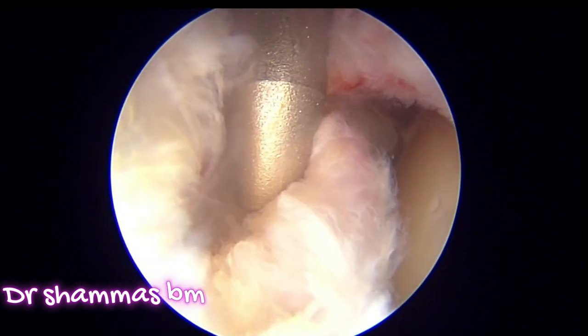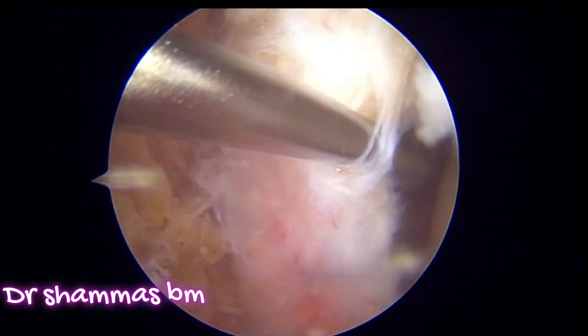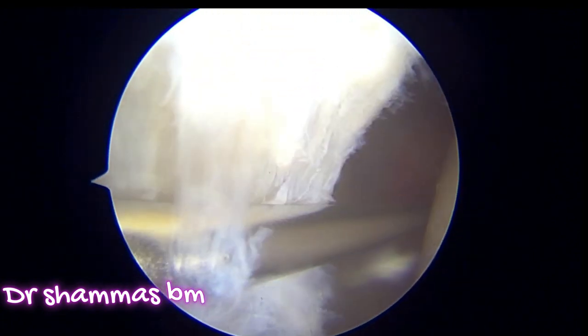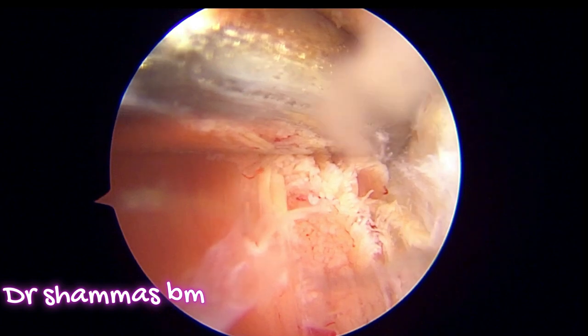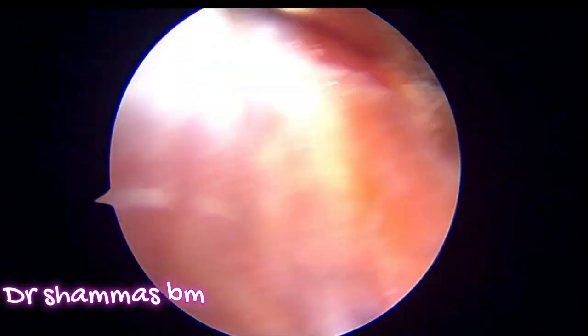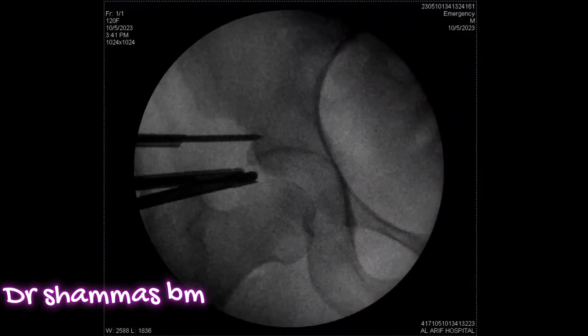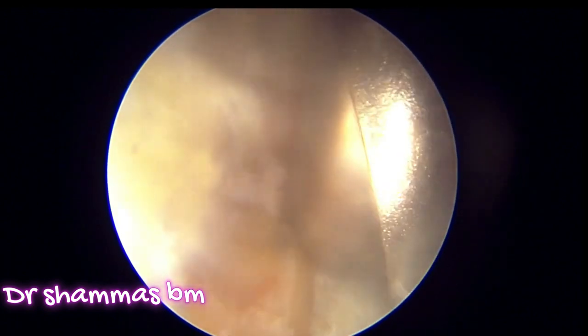We need a third portal for completing the procedure — we are using an accessory anterolateral portal. We put the cannula and repeat the same procedure as above; you can confirm placement with the image intensifier. Here I am using a Steinmann pin to remove soft tissues coming into the field by securing it into the bone. The next and most important step is using a high-speed bur to remove the pincer lesion. The bur is protected on the labral side so that you do not go into the labrum.